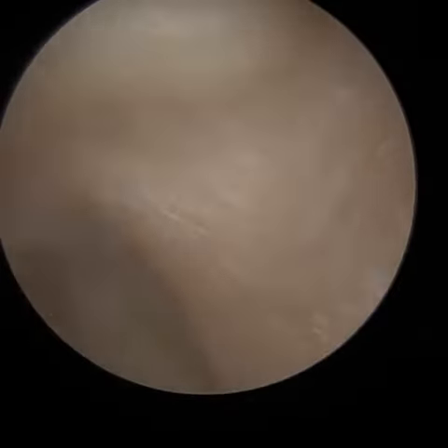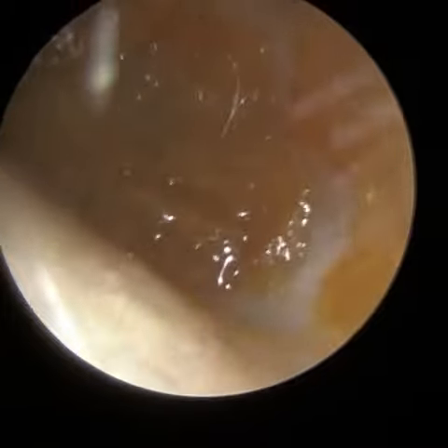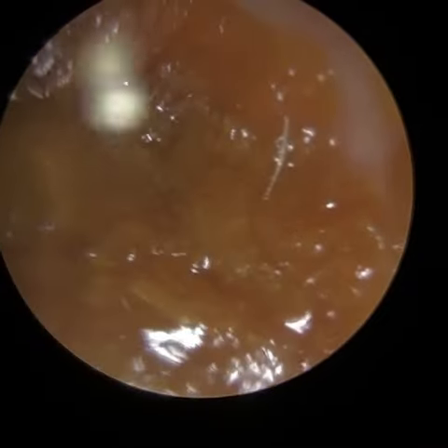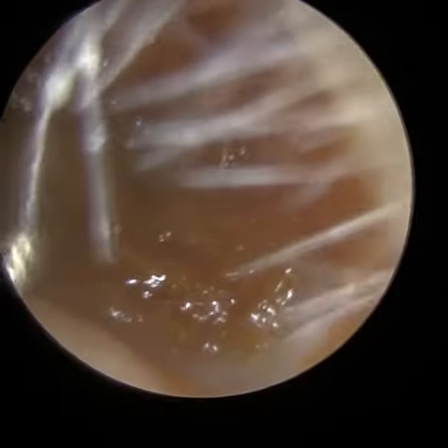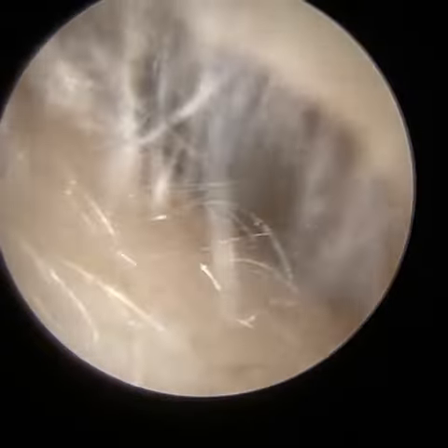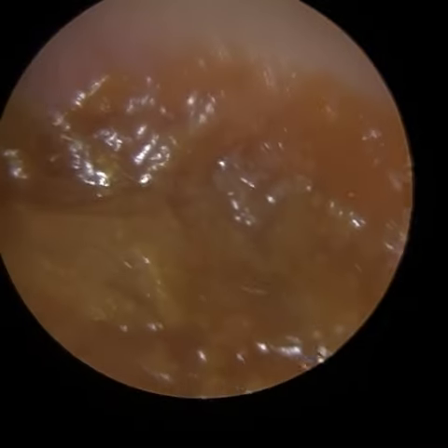Hi everyone, this is Mr Neil Reiteter, Consultant Audiologist and Director of Clearwax. Thank you for joining me in another demonstration video of our recently developed Waxscope, which is due to be launched in early January 2023. There has been a slight delay, but we've been reassured things are looking good for the new year.